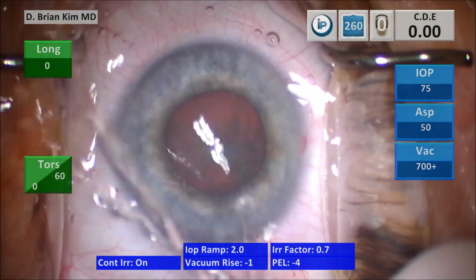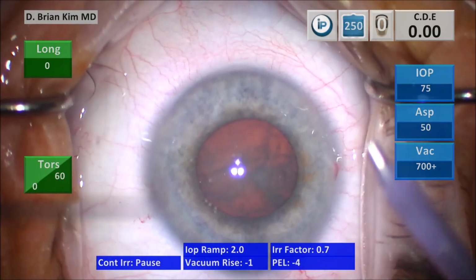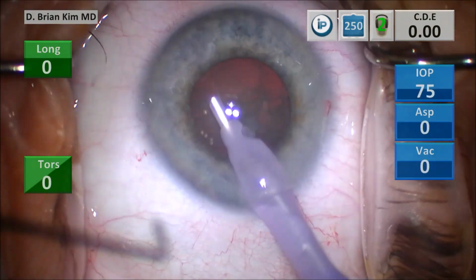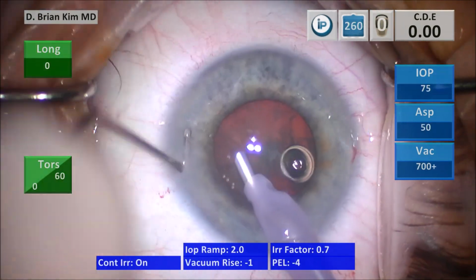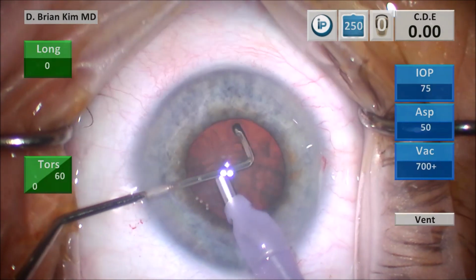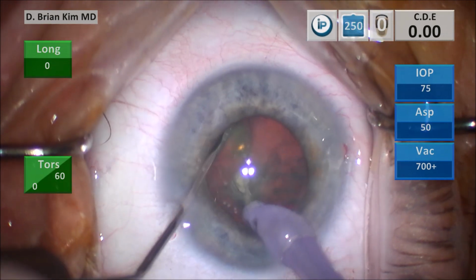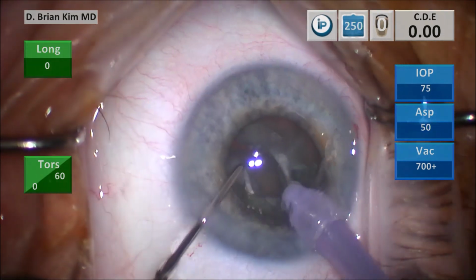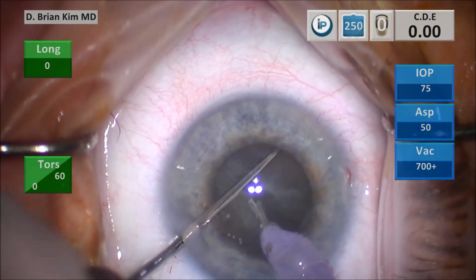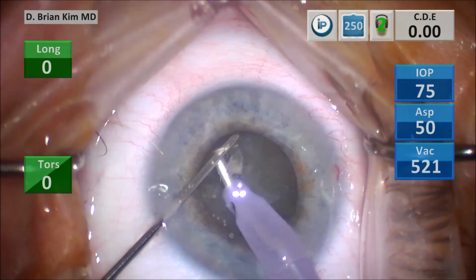You go in with the phaco, irrigating the surface of the eye first, making sure there are no bubbles in there, lifting the incision with the chopper and going in with irrigation off to minimize Descemet's trauma, removing the surface epinuclear material. Place the chopper out to the equator, place the phaco tip vertically subincisionally, crush the lens in half, and that's the double chop. Place the chopper out to the contralateral equator, pull it towards the center, and that crushes the right heminucleus in half. That's the cross chop maneuver.